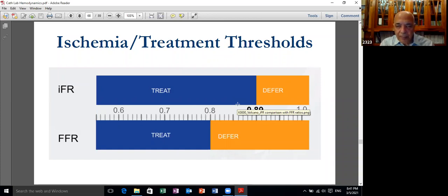And in patients with saphenous vein graft, the lesion is rapidly progressive. So you cannot guarantee that if you defer, you get this 5-year warranty period. So apart from these three conditions, you can apply FFR or IFR equally effectively and very fruitfully in predicting which lesion is going to be dilated and results in an optimal outcome. So with this, I think we finished this curriculum and we get the questions.